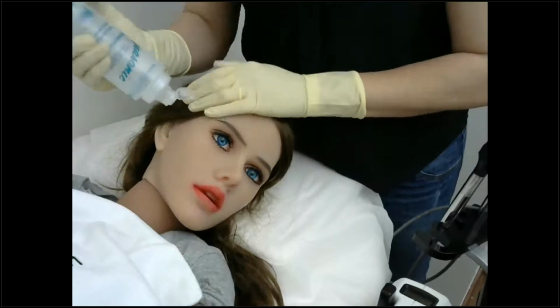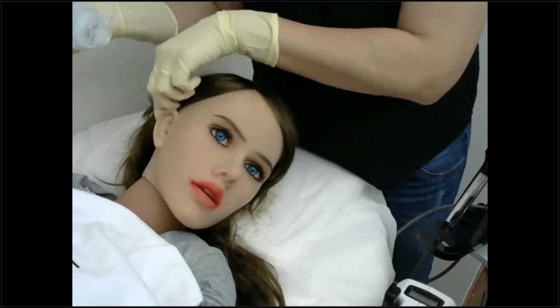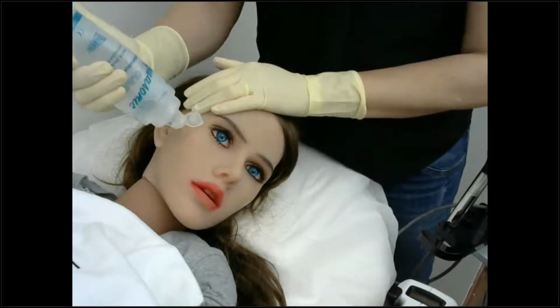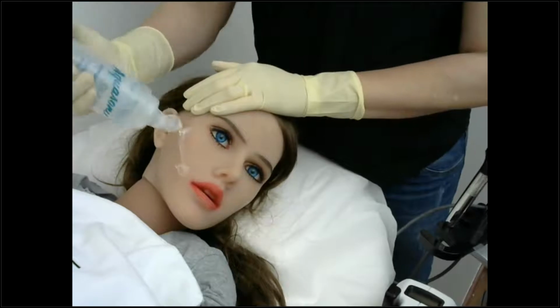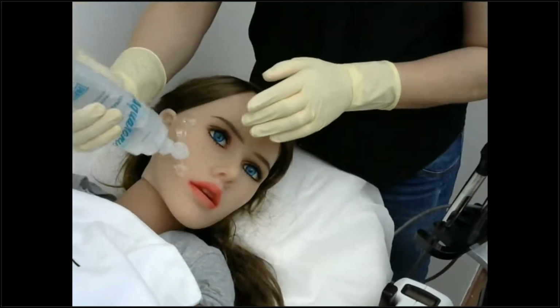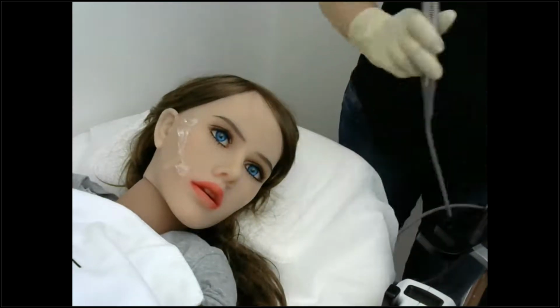I know a lot of, especially new, therapists don't fully appreciate the need of them being comfortable. So make sure that you're comfortable. If you're more comfortable standing, give treatment standing up. If you're more comfortable sitting down, then do that. It is crucial for a good treatment as well.